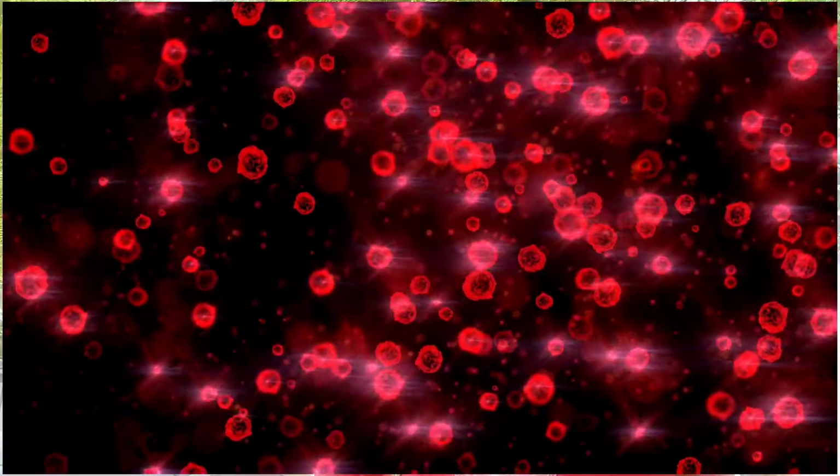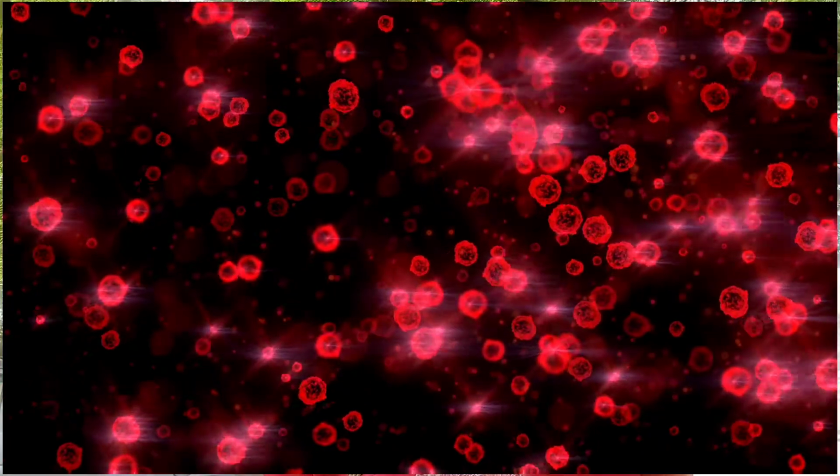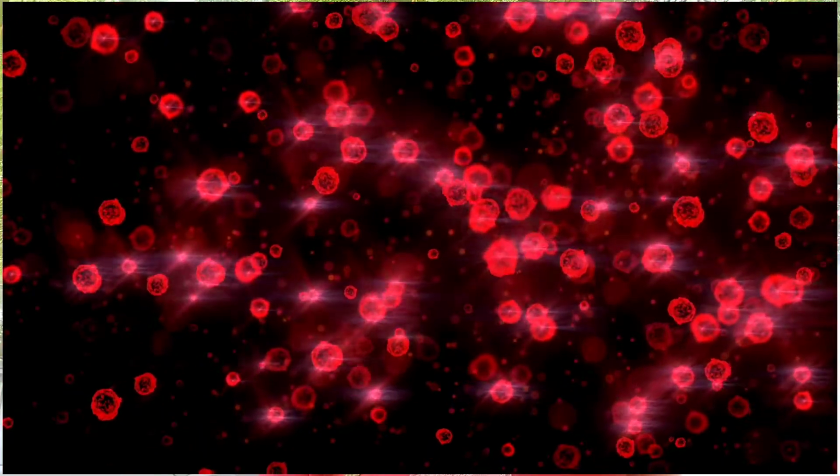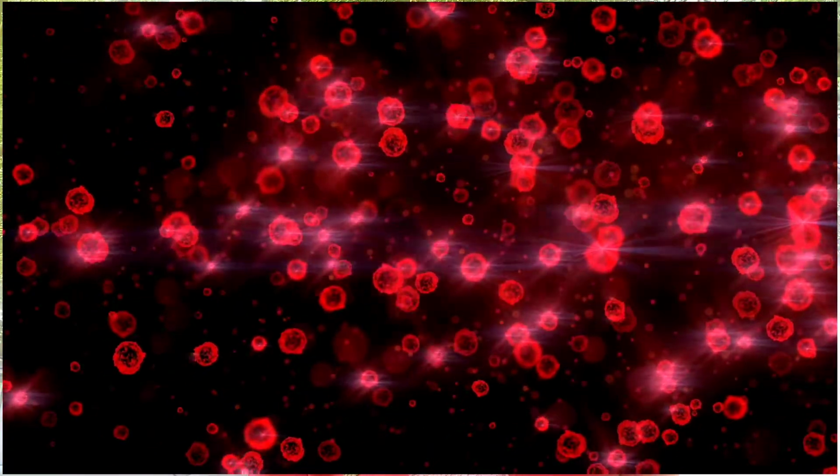Another thing that can be seen in urine deposit is red blood cells. Red blood cells are seen in female urine samples, like a menstruating female. You can see red blood cells in the urine samples. But if the lady is not menstruating, there is need for further investigation to know what is causing that presence of red blood cells. And if it is seen in a male sample, it is good to also do a further test to know what is causing that blood being seen in the urine. So red blood cells are seen in urine deposit too.